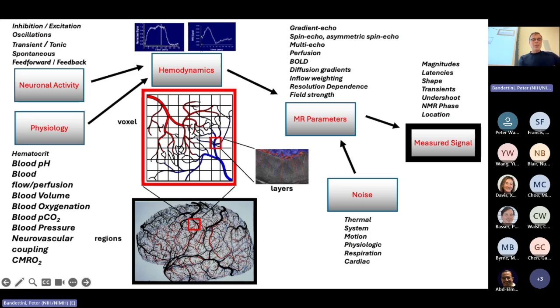But then you have this hemodynamic response function that smooths the signal, but it also varies depending on how you capture the vasculature with your voxels. And that will skew the results. That will cause differences in what you see on a voxel-wise basis. But there's all this physiology that goes in the signal, and some of it doesn't matter.